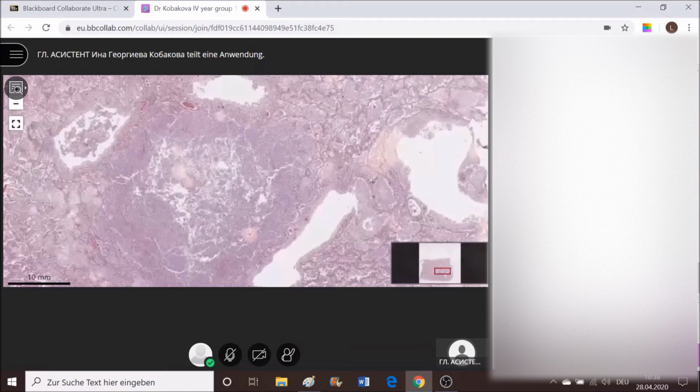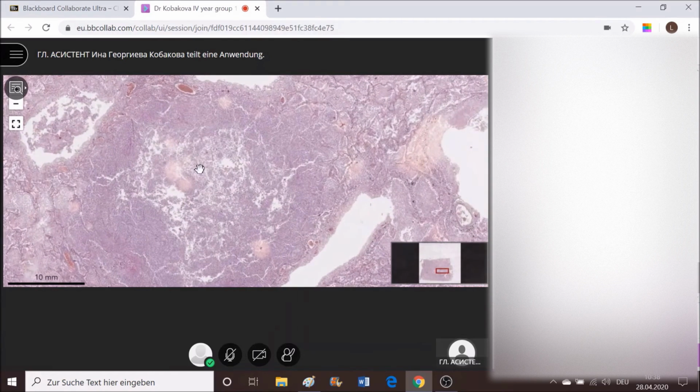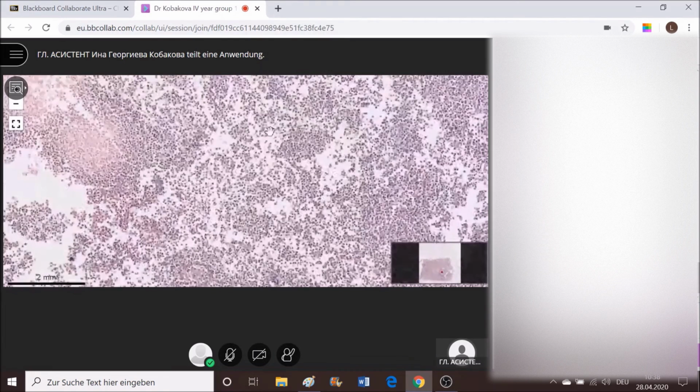You don't see the pus yellow on the microscopic slide. You will see it grossly yellowish. Histologically, it appears bluish because there are lots of neutrophils on the inside. But grossly, yes, it appears yellowish due to pus. That is acute inflammation. Great. So how many types of abscesses do you know now?